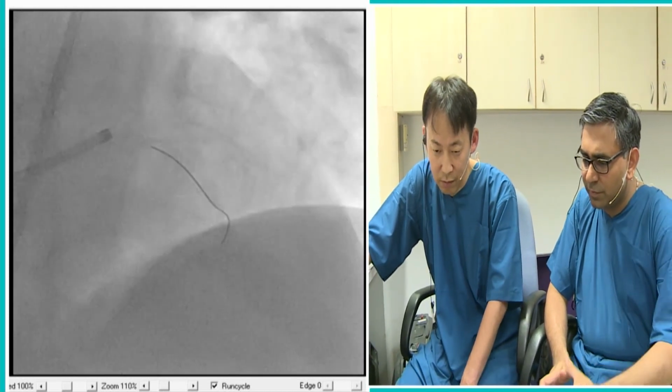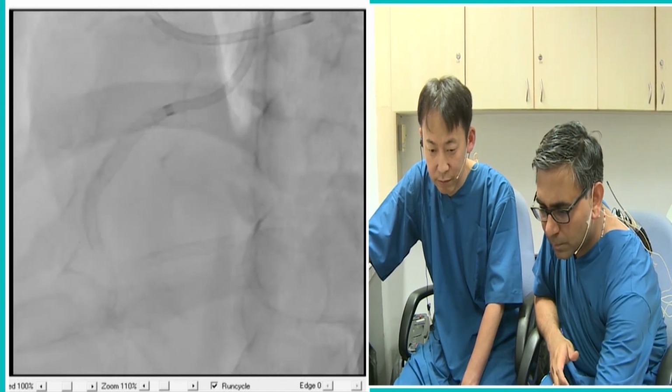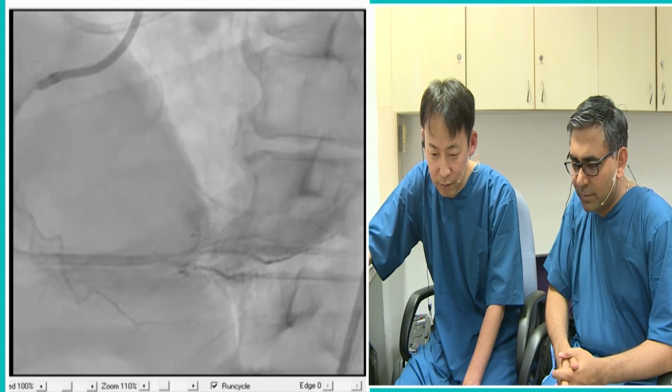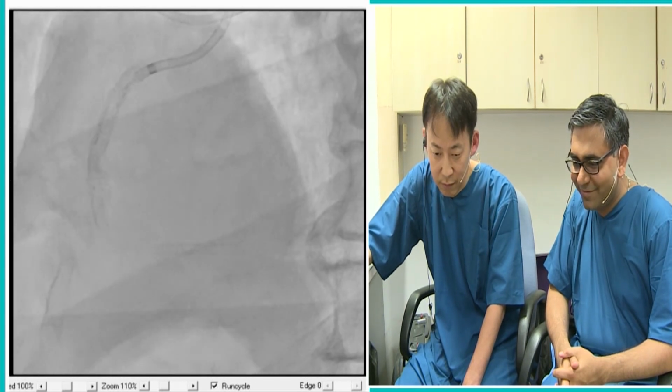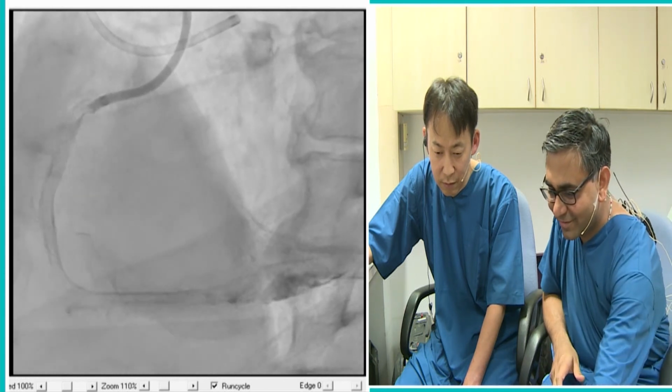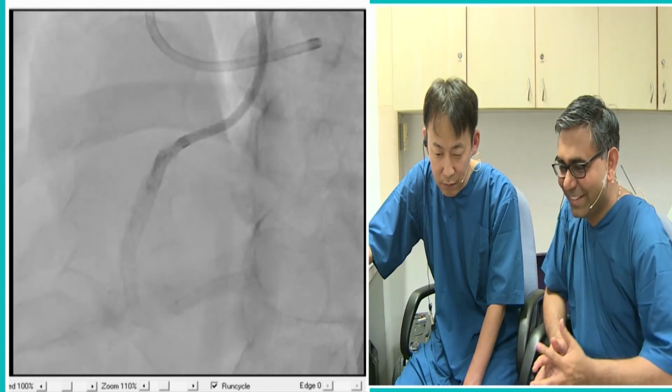Dr. Batra, anybody from the panel? So the case has been nicely done by Dr. Nasu and Dr. Rishikesh, and it seems this CTO has been opened with a robotic approach, sitting in a console room and watching the case.